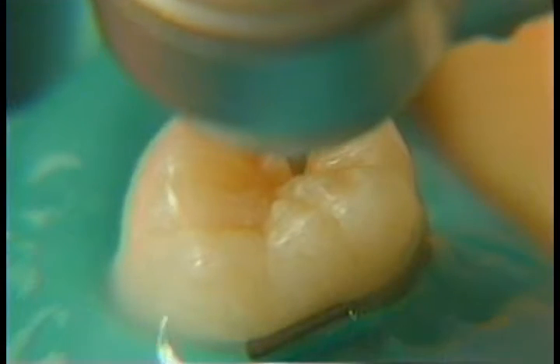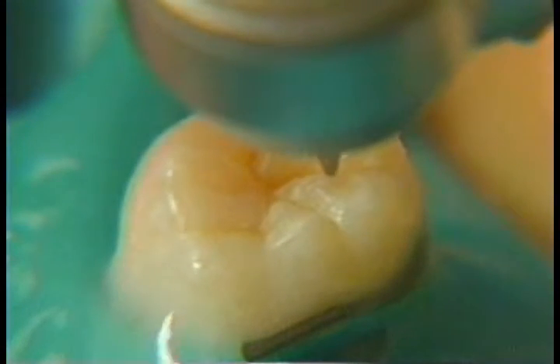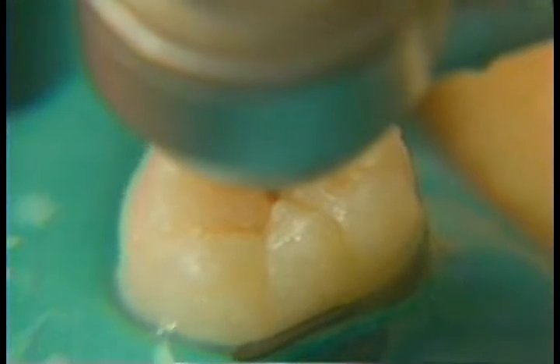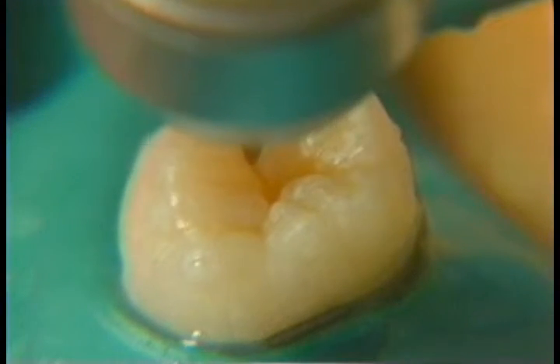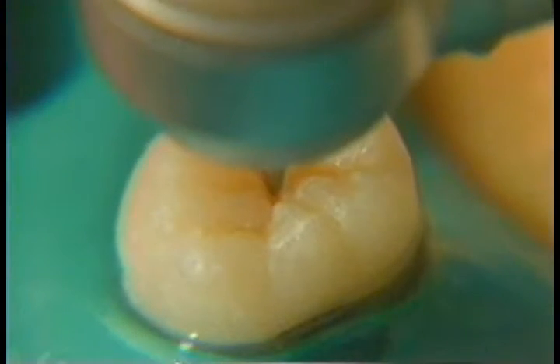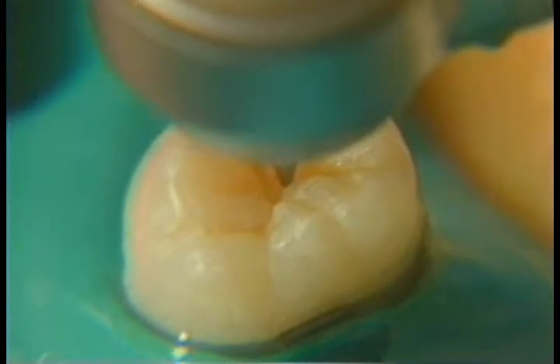Using just the tip of the burr initially, and I see some decalcification in the enamel. Follow along here — and right there, some dentin caries.